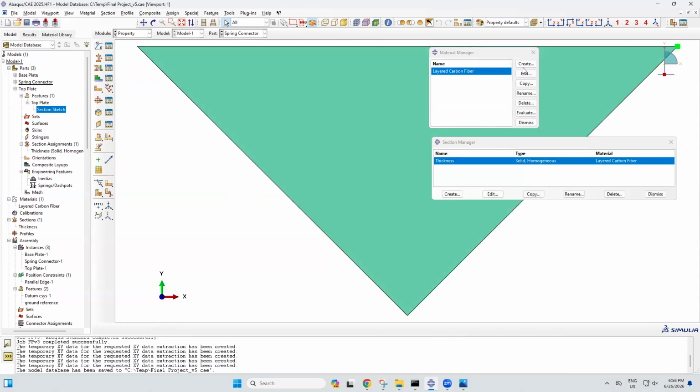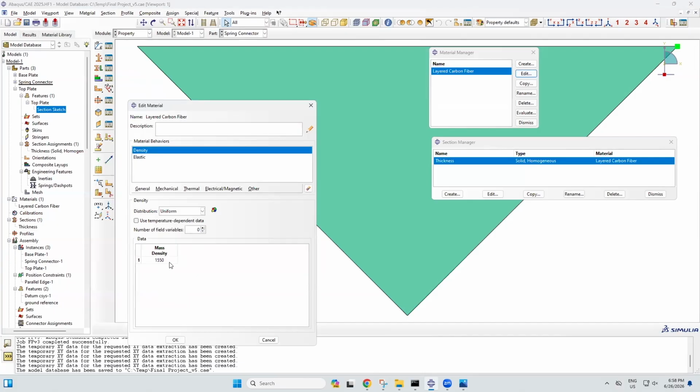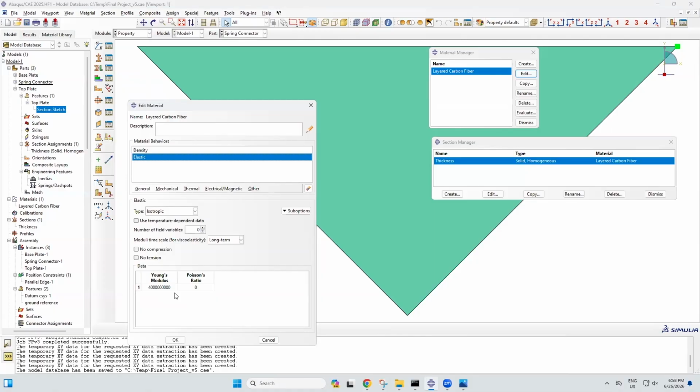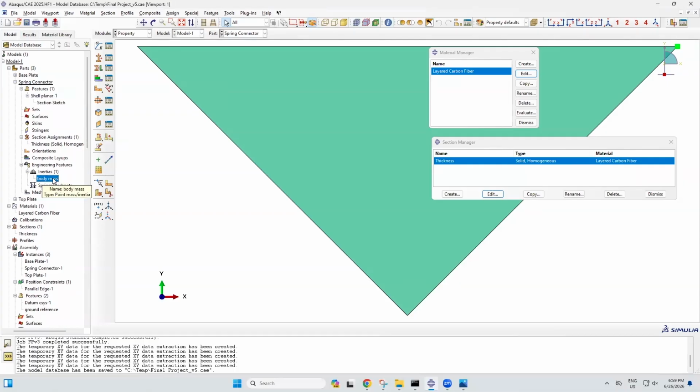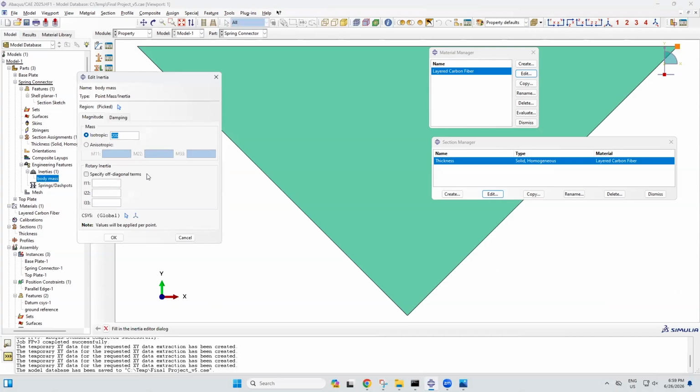So I'm using layered carbon fiber, which has a mass density of 1,550 kilograms per meter cubed and a Young's modulus of 4 gigapascals. Next, I created the section, which was the layered carbon fiber I just created in the materials, and has an overall thickness of 8 centimeters, which is the overall width of each plate in the prosthetic. Additionally, in the property manager, I created a body mass or inertia for the spring connector, which has 200 newtons isotropically applied, and it is used to create a realistic body weight and in turn result in realistic deformations.